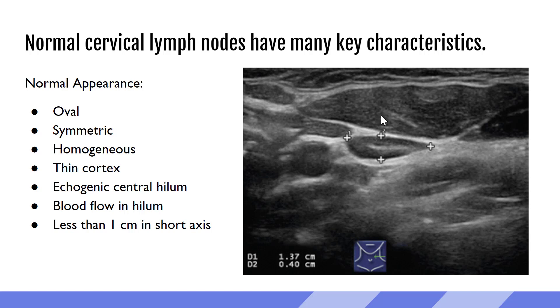We can see the sternocleidomastoid muscle here, the strap muscles, and the carotid artery. This is our lymph node. Right in the center is this very echogenic area — a line through the middle. This is the echogenic central hilum that we talk about. It's made of fat, so it has a very bright appearance on ultrasound. Around it is a more hypoechoic cortex — thin, homogenous, symmetrical — surrounding that echogenic central hilum. This is what we expect to see.